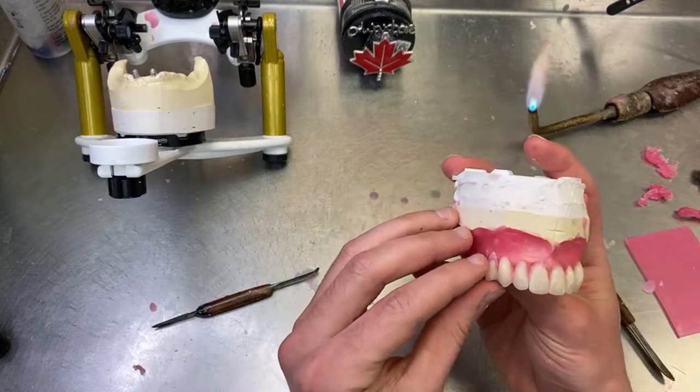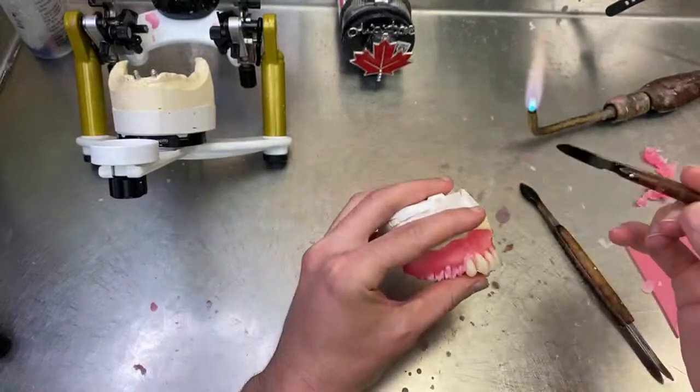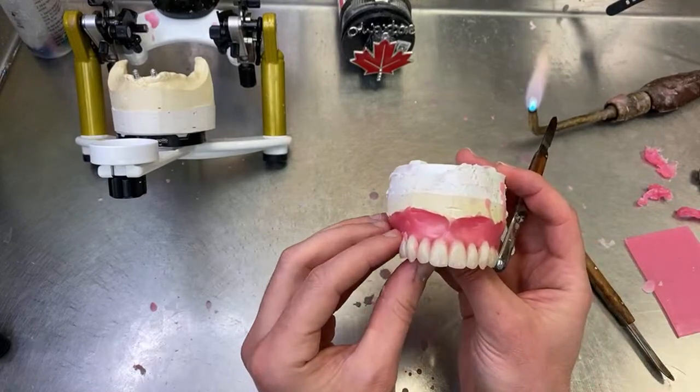So symmetry is important when the patient has symmetrical features. You will notice, like in some patients, one side is lower than the other or such.